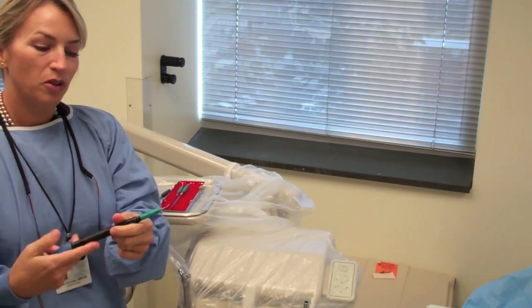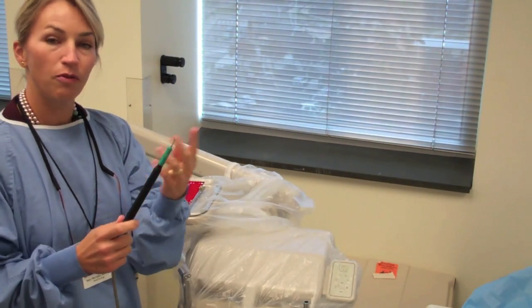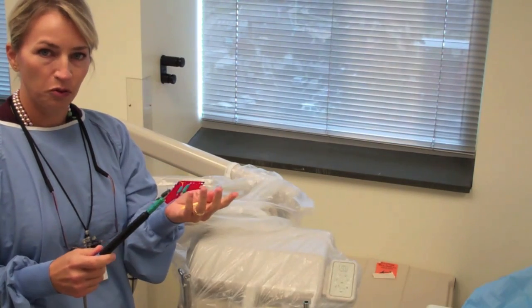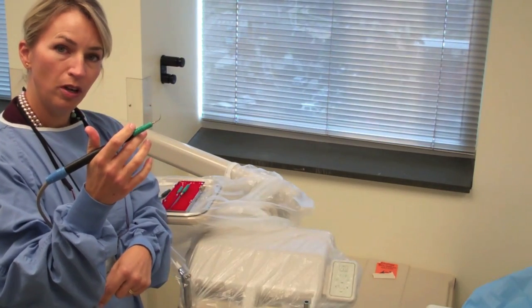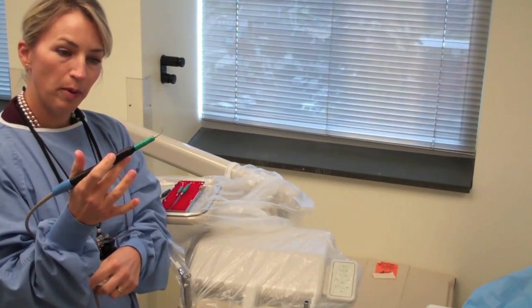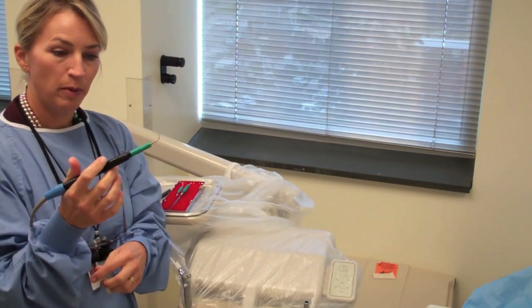The first thing, as far as selecting your insert, is the Slimline insert that you see here for this brand, and of course you're probably using your own brand of ultrasonic insert. This is an insert tip that is used for biofilm disruption or plaque control. So this is a really good insert to use on your recare patients, and also on your perio maintenance patients.